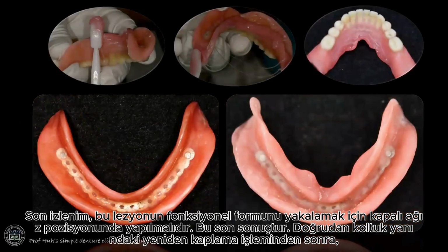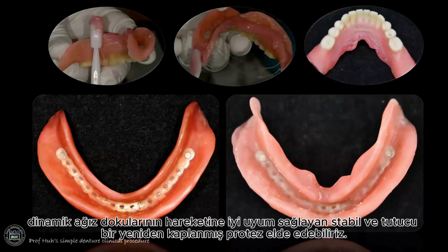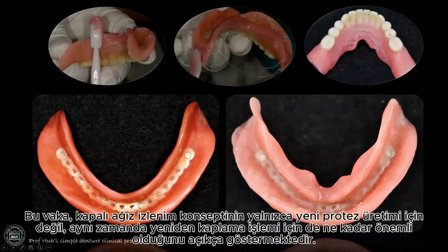So this is the final result after direct chairside relining. We can achieve a stable and retentive relined denture that adapts well to the dynamic movement of the oral tissues. This case clearly demonstrates how the closed mouth impression concept is essential, not only for new denture fabrication, but also for relining procedures as well.